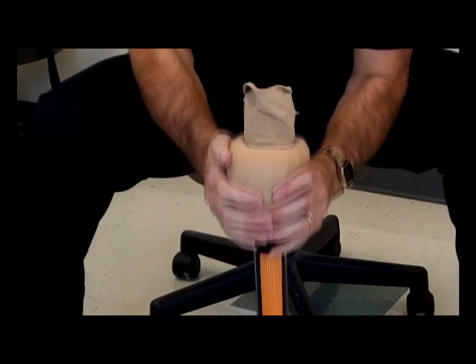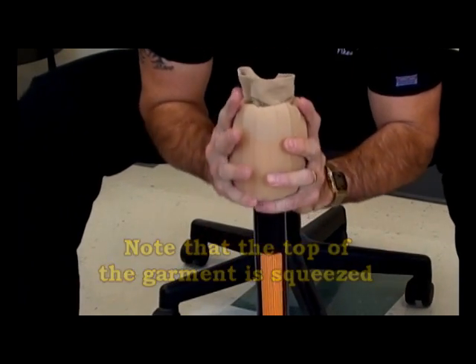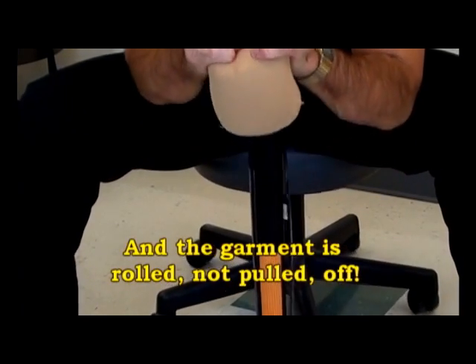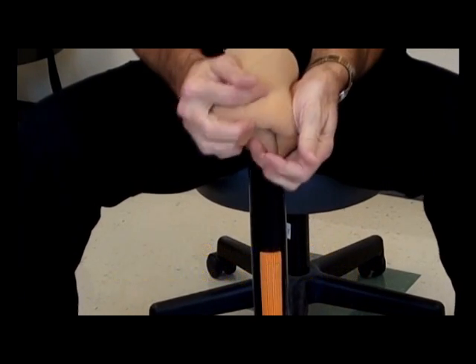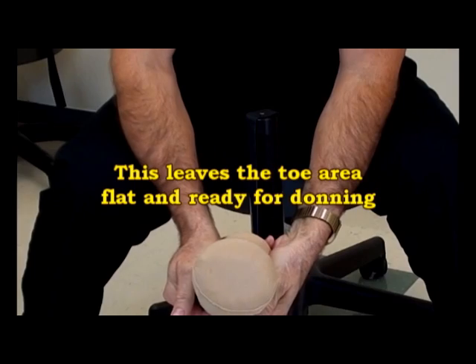Here's a closer look at rolling, not pulling. Note that the top of the garment is squeezed and the outsides are rolled. Then roll the garment off of the pole. You know you've done it correctly when the toe area is left flat and ready for donning.